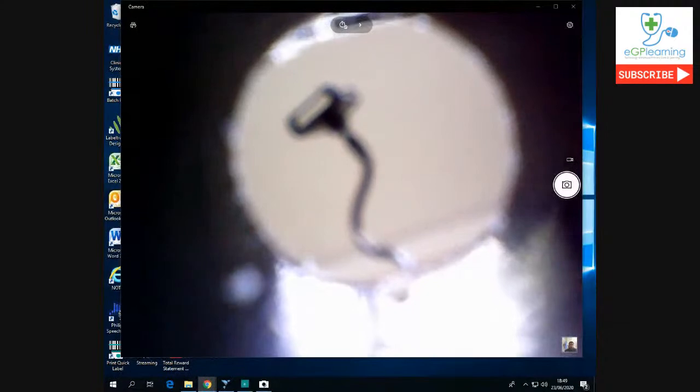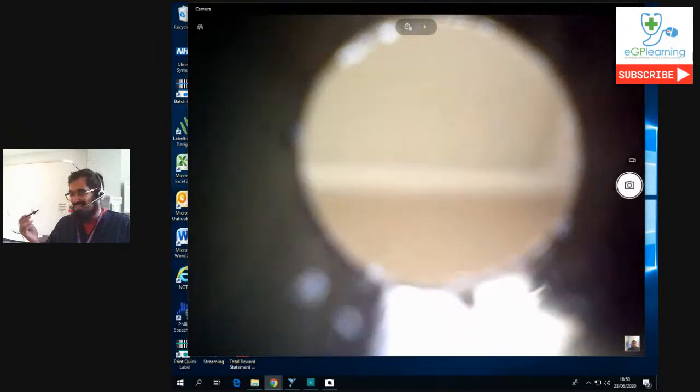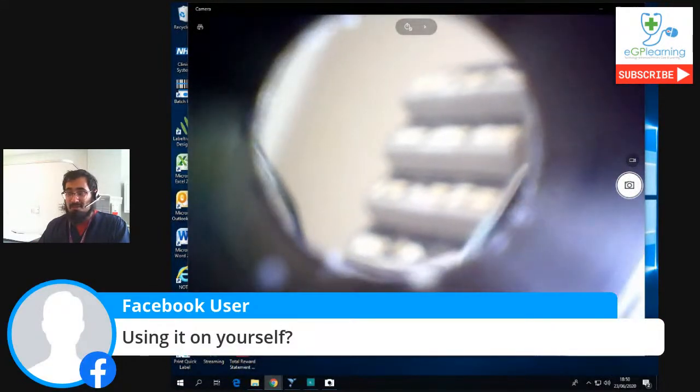So make that bigger, bring that across. So right now you guys can all see my window and my phone holder. And now you're going to get to have a look inside my ear. Now, just so that you guys can see what I'm actually doing, this is going to be interesting. So I will point out, I'm using it on myself. Don't worry, it's a clean cap and I'm going to throw it away. So comment if you want to know whether I'm using it on myself. Yeah, I'm going to use it on myself.